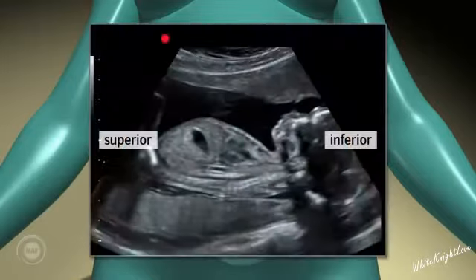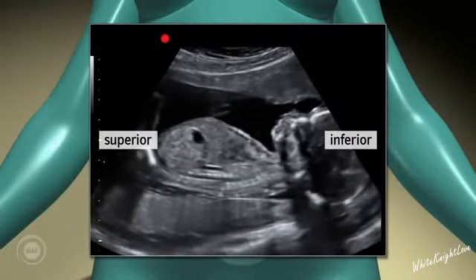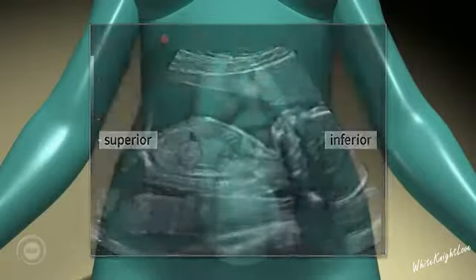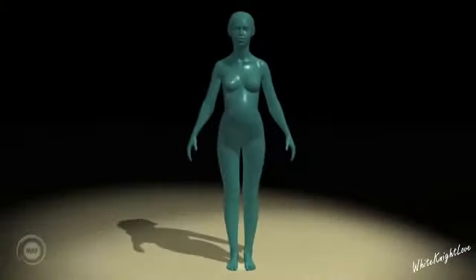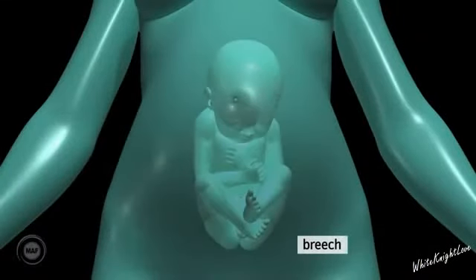As a scan image, superior is represented to the viewer's left on the screen, and inferior is represented to the viewer's right on the screen. Cephalic presentation. Cephalic describes the fetus in the head-down position inside the uterus. The head of the fetus is at the birth canal, in other words, just above the pubic bone. Breech presentation. Breech describes a fetus with its breech or bottom lying close to the birth canal, just above the pubic bone.